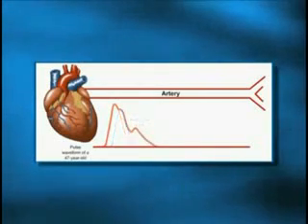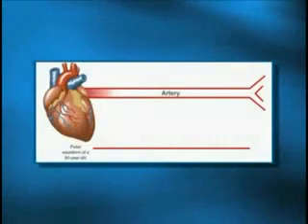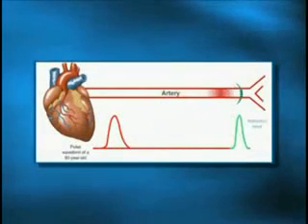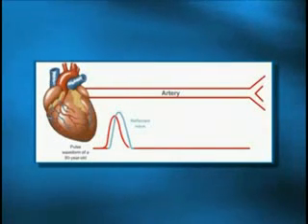So what you get is actually a wave and an extra load for the heart to fight. So you are fighting your oncoming wave. Does the person feel anything? The answer is no. Now if you were to look at an 80-year-old, you see a very stiff artery, and when the heart pumps, the wave travels so fast, it comes back right at you at the systole.